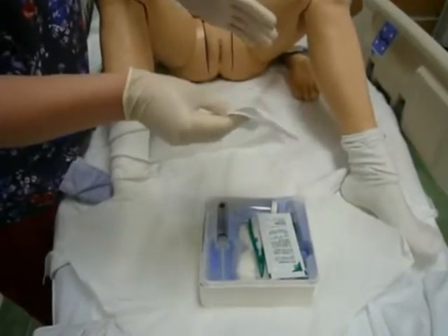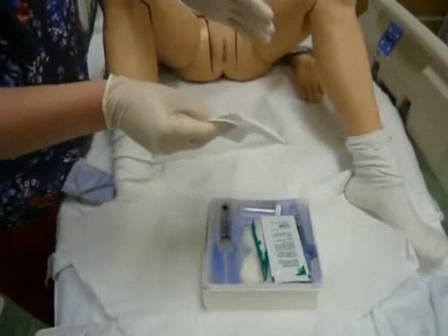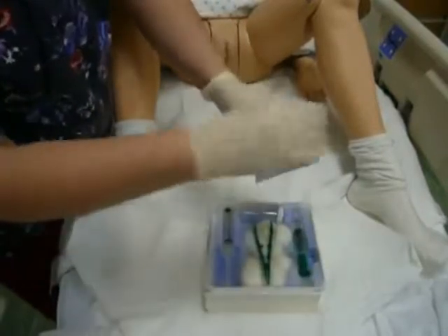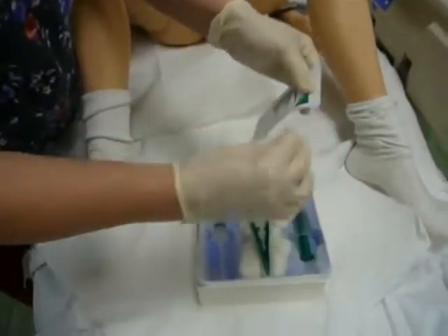Or I can have a garbage at my feet, which I will drop from waist height into the garbage can, making sure they don't contaminate. You'll open your iodine package — I'm not going to do that because it's very messy. You open your iodine package right here, tearing down.